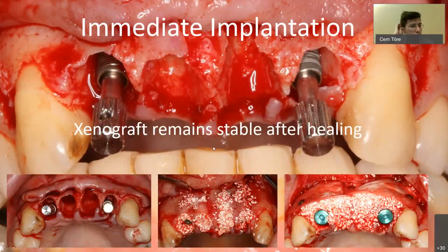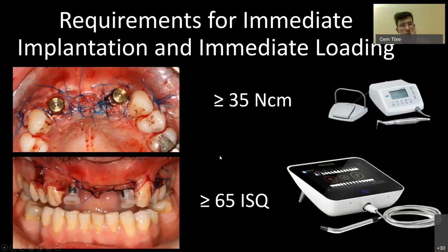Yes, the reason we use the xenograft in most of my cases in this presentation is because xenografts are basically forever, like they say about diamonds. When you successfully place a xenograft in a patient and it heals in a socket or on an augmentation, you can rest easy knowing the patient will carry that xenograft for the rest of his or her life. It will not resorb, it will not go anywhere. It will stay the way you put it, in the place you have put it. So they are very, very stable in that regard.